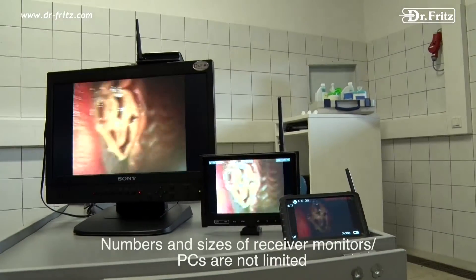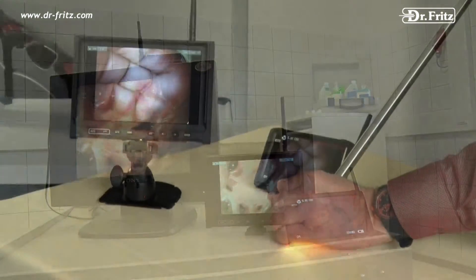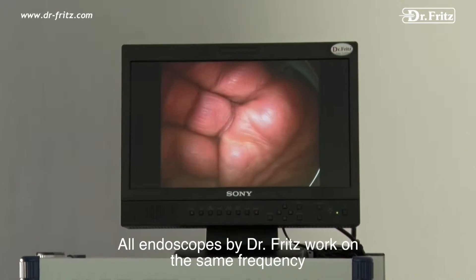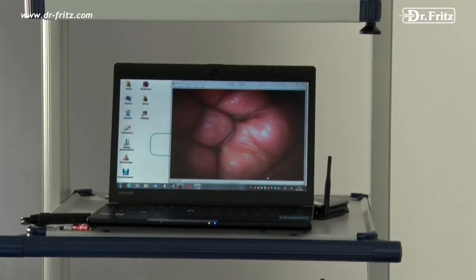The size of the monitor screen depends entirely on the requirements of the practice or clinic. All wireless endoscopes by Dr. Fritz, including the LED video endoscopes, work on the same frequency so that monitors and PCs are independent of the endoscope type.